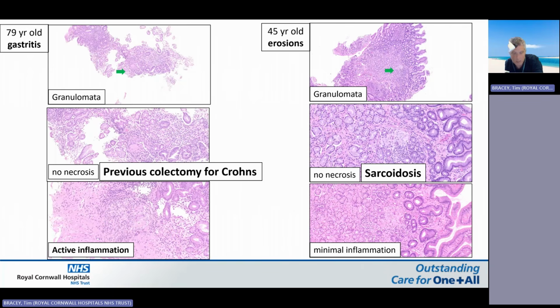Another case that I've had recently with granulomas, interestingly, had dysplasia and a carcinoma in one of the biopsies. So presumably, some of these patients can also have granulomas as a sort of paraneoplastic phenomenon. So don't let one diagnosis distract you from other possible ones that might be more serious.